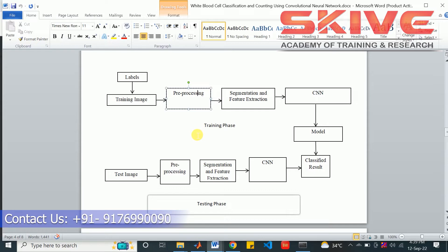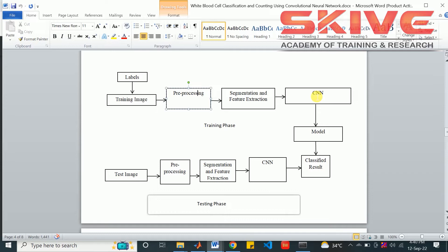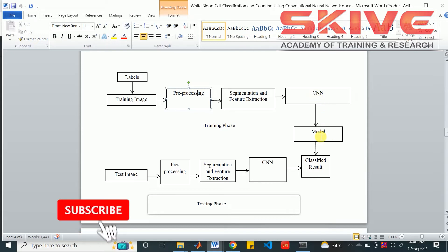After the preprocessing, segmentation will be applied and feature extraction also happens for the image, the dataset we have. After that the convolutional neural network will have that model. The features will be extracted to the convolutional neural network for creating the model. The CNN with its layers will create the model for classification.